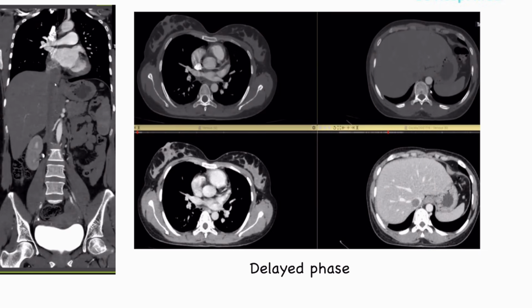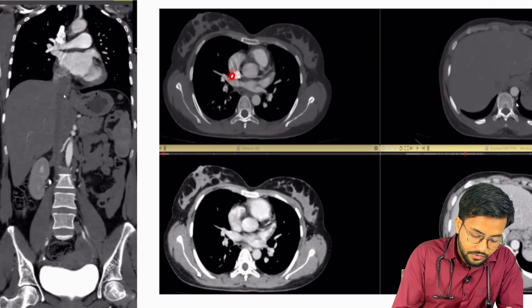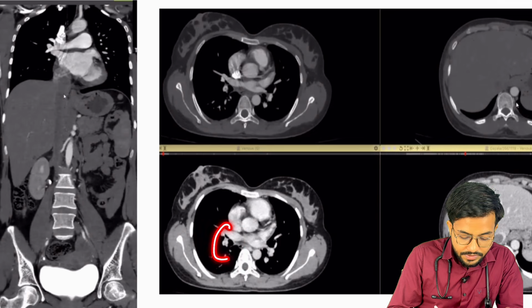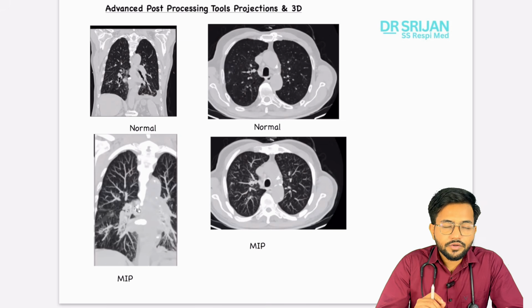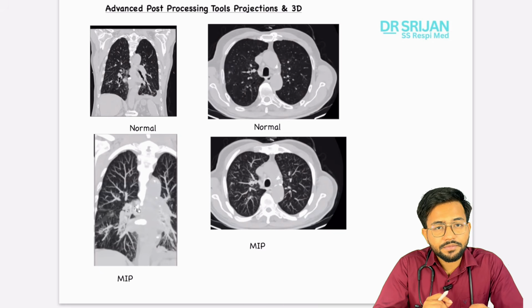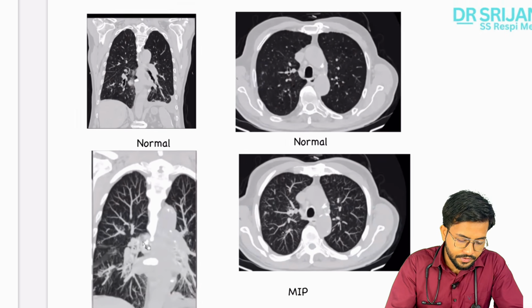And to show you one more picture, do you see a small dot over here? This is without contrast and this is with contrast. So chances of picking thrombus are much higher if we are using contrast. Okay, so now when the CT scans are taken, we can reformat the raw data and produce some specialized images. I want you to focus over here.